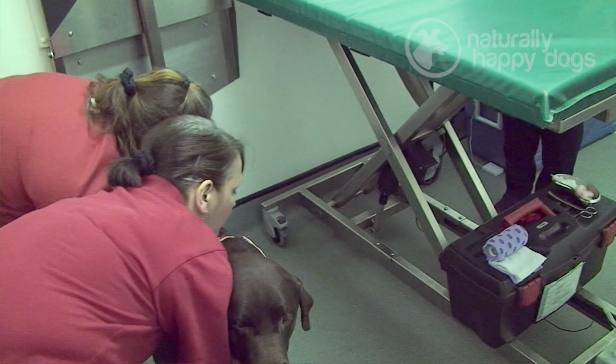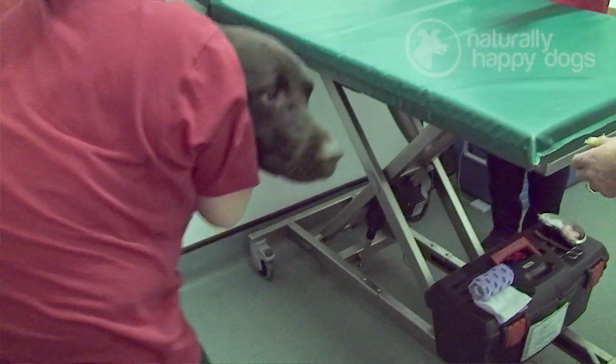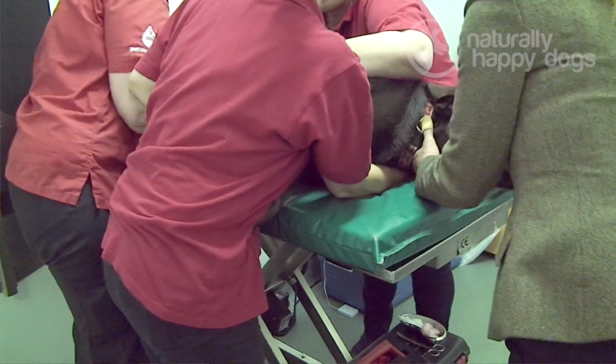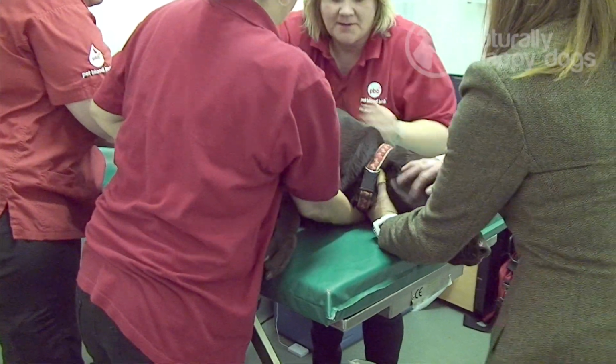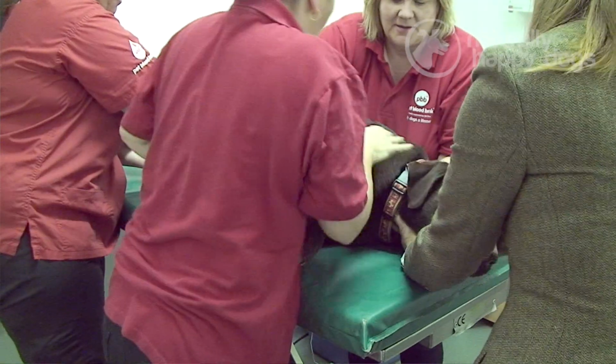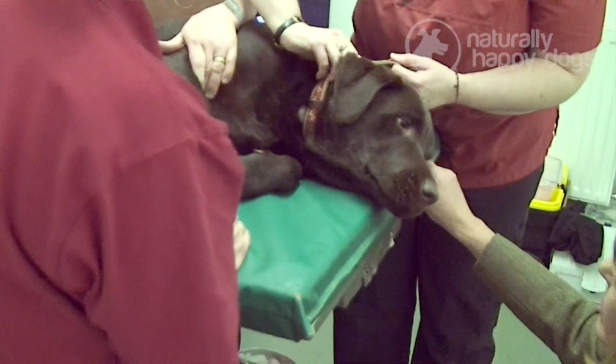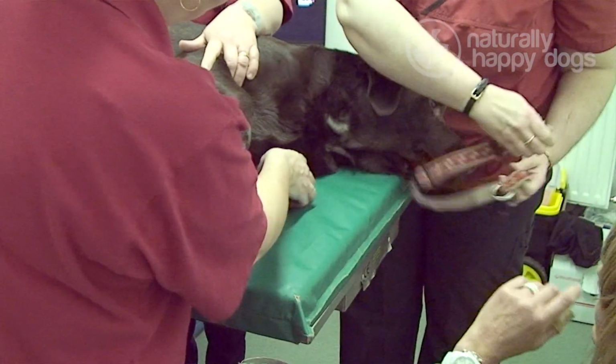As long as your dog passes the full physical examination, which will be done by a vet, they will be able to answer any questions that you have about the donation process. You will then move through to the donation room, and our qualified veterinary nurse, assisted by 2 more animal care auxiliaries, will lift your dog onto a table where they will lie on their side and be given lots of fuss, treats and reassurance.